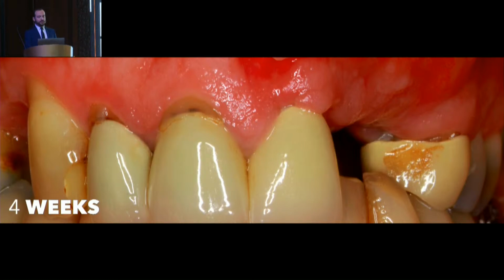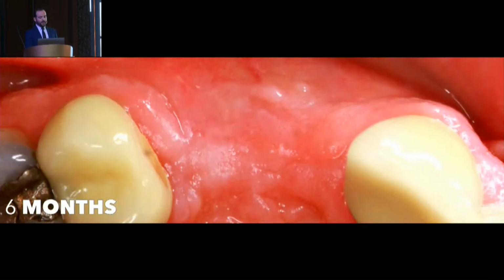Here we can see the result. Again, at 4 weeks, in a buccal view, we can see that that little bit of a defect, or the vertical defect, even though it was not the main purpose of this procedure, we also were able to correct it through this technique. Here we have a longer follow-up.